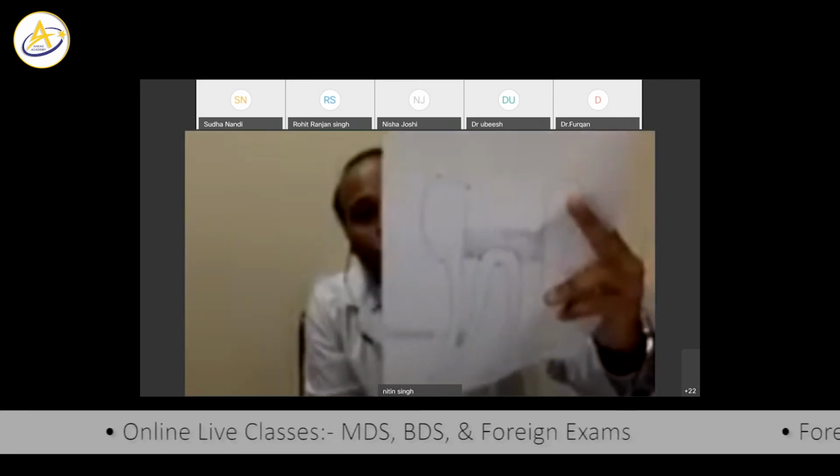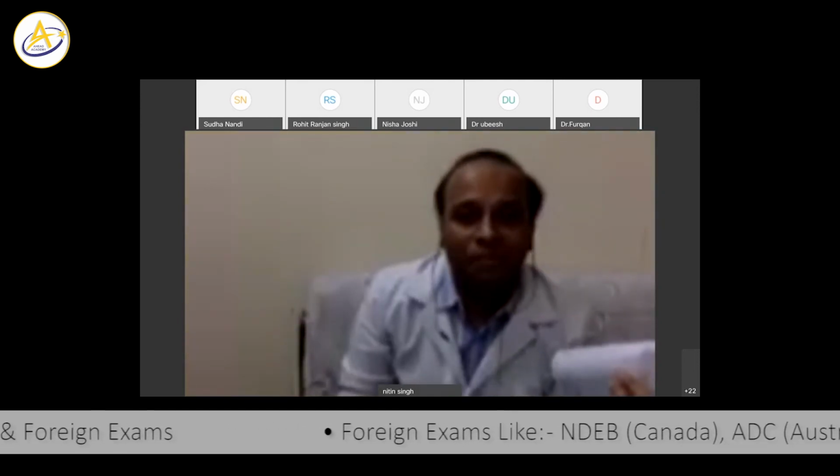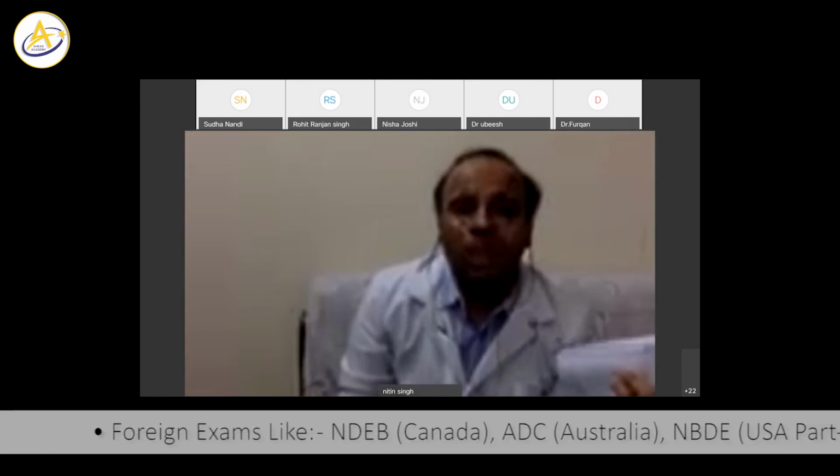This is what you can see after access opening. However, finding diffuse denticles and pulp stones is not mandatory. In some cases you may find these calcified masses, and in some cases they need not be present.